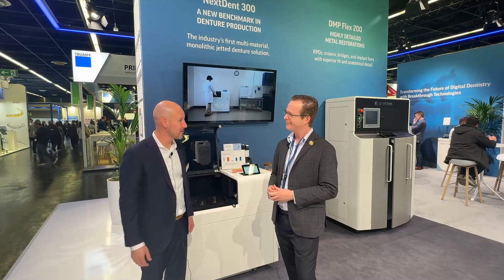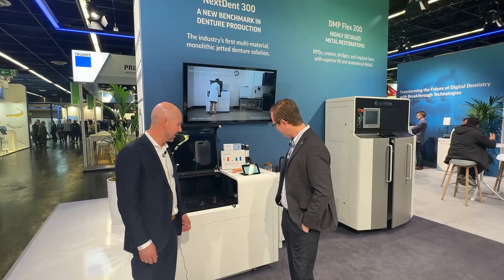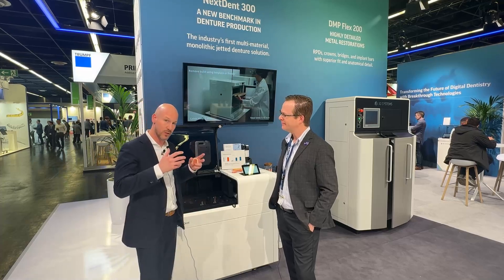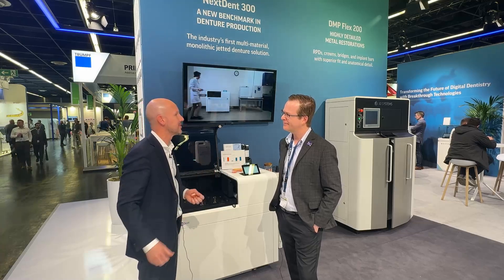Absolutely, great to have you. Thank you for coming by. What we have right here is our Nexdent 300, the jetted denture solution. It is a multi-material printer focused completely on dentures. It's a full denture printing solution where we print both the base and the teeth at the same time to come out as a fully ready-to-use denture from the printer.